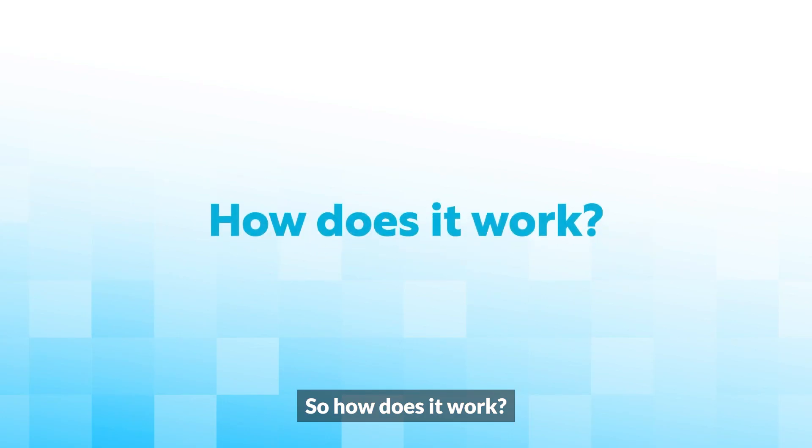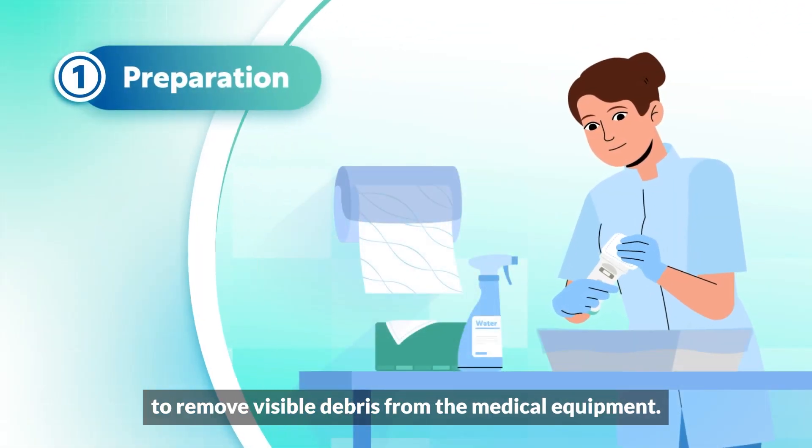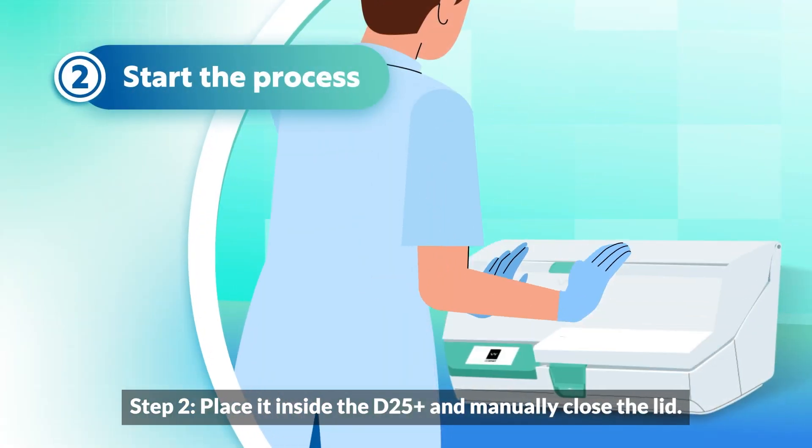How does it work? Step 1: Use a microfiber wipe dampened with water to remove visible debris from the medical equipment. Step 2: Place it inside the D25+, and manually close the lid.